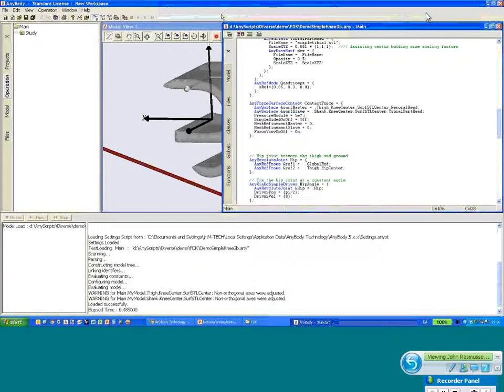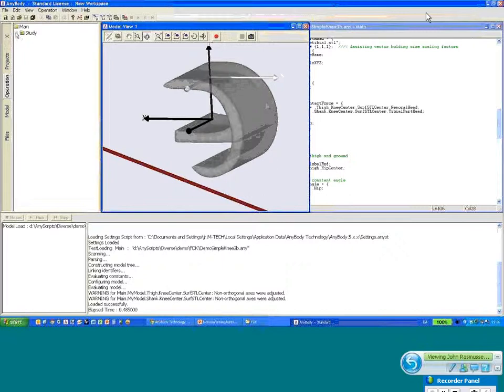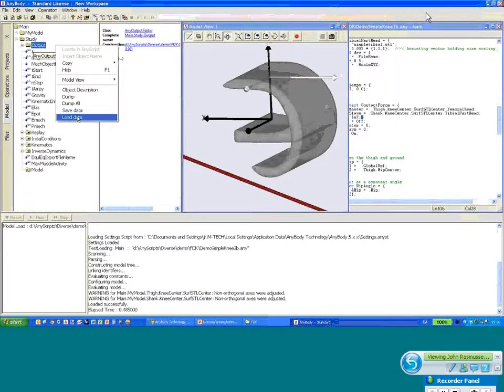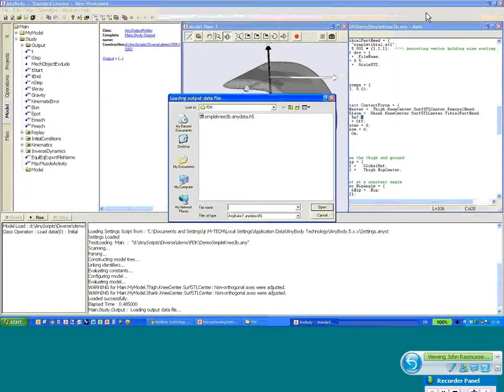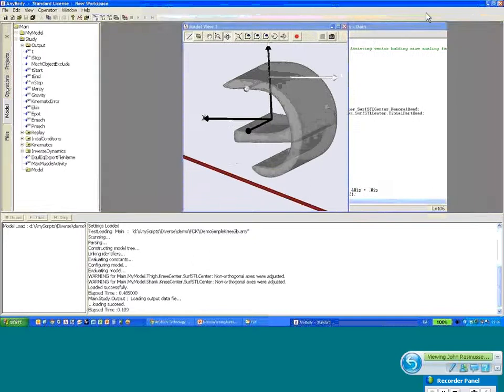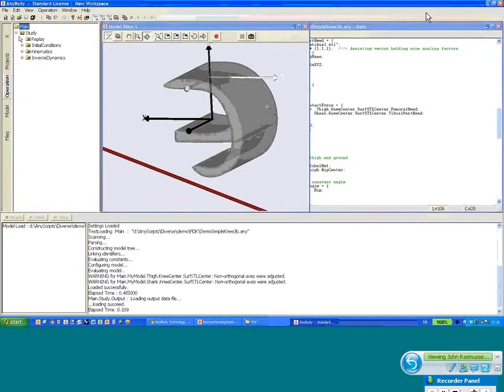Now it takes a bit more time to analyze this, so I have cheated just a little bit. I'm going to go into the model and the study, and then I'm going to read in some data that I analyzed earlier. So I'm going to load those, and we have them here. And now those are loaded, and that means I can run a replay of the model. So instead of doing the actual analysis, it will run much faster.